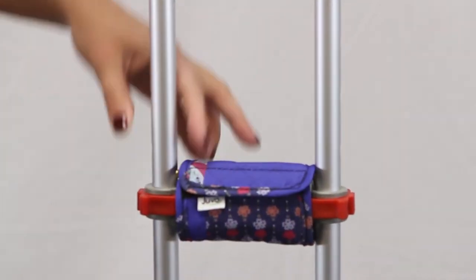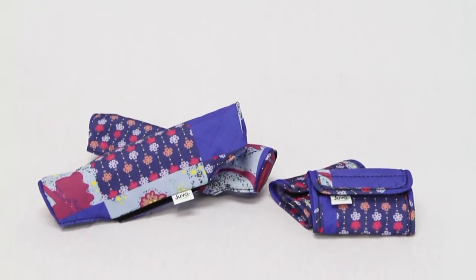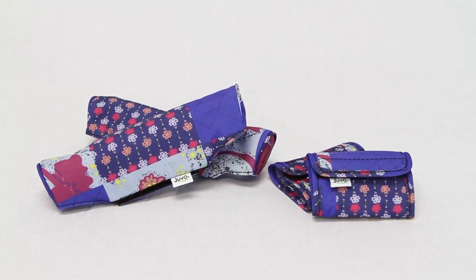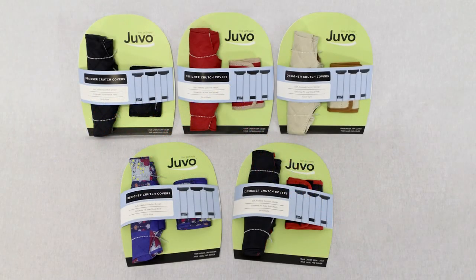Crutch when you must and do it in style. Crutch covers are made from polyester and are hand washable. One pair of underarm covers and one pair of hand bar covers are included. Five colors and patterns are available to choose from.